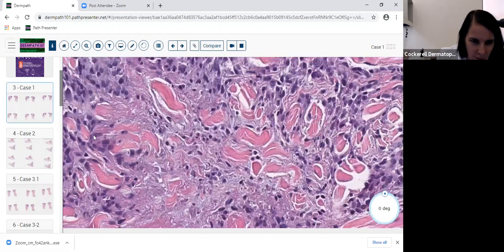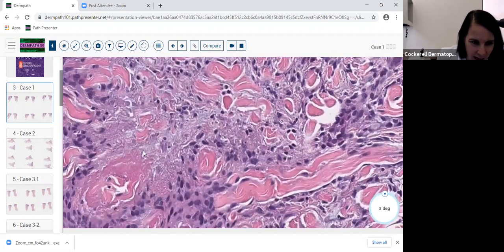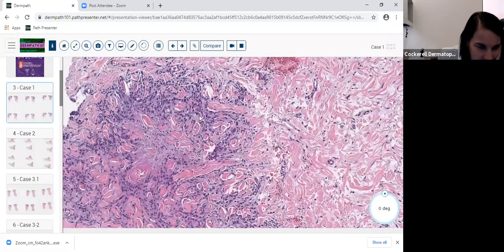But the thing that jumps out at you right away is this central area that's sort of feathery, granular, light bluish. And if you wanted to, you could stain it with a colloidal iron, or you could stain it with an Alcian blue. And that would say, so this is mucin. It's a palisaded histiocytic reaction, therefore granulomatous, surrounding this central area of mucin. So, I think this is GA.